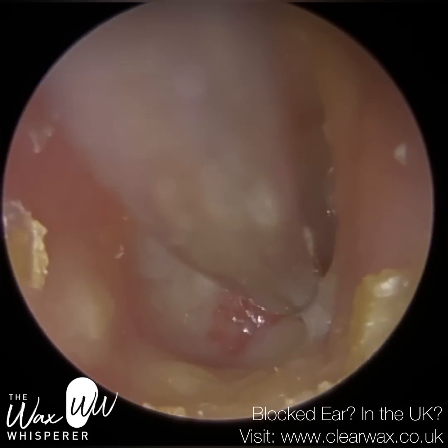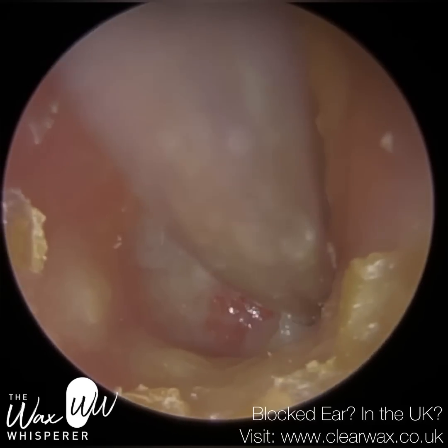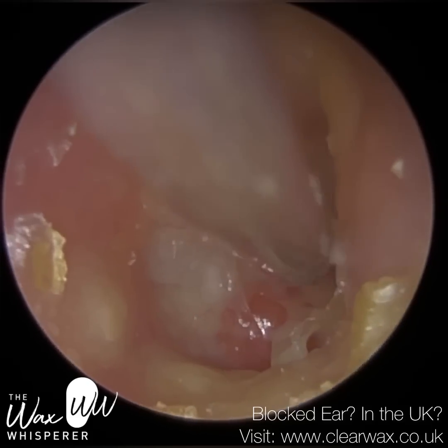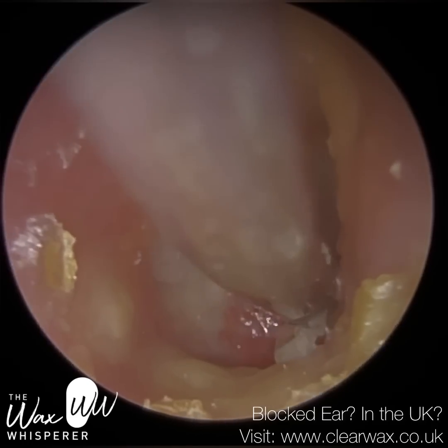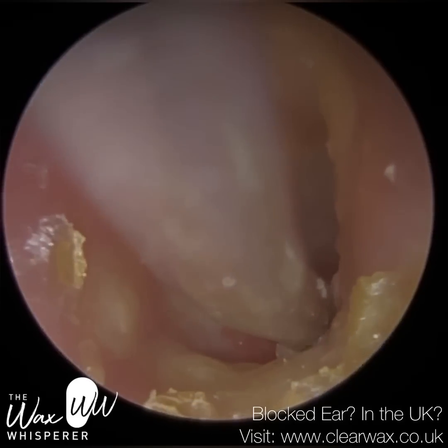I'm using the fine end suction probe, and this is going to be quite revealing in a minute. You're going to see a lot of damp, dead skin. So we call this squams of skin. And it's going to come away. It's hidden in the inferior and anterior recess.